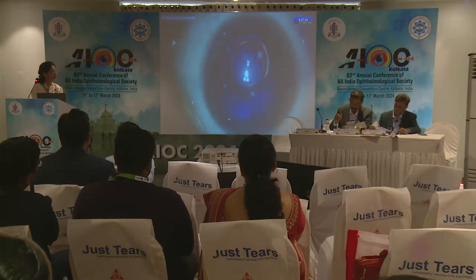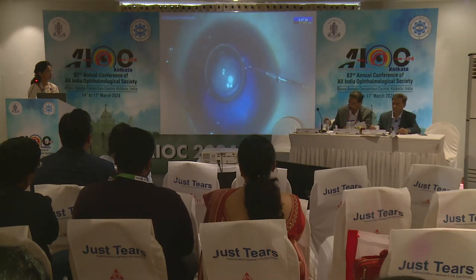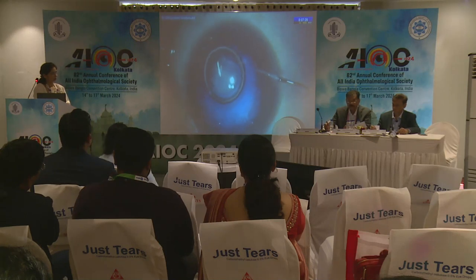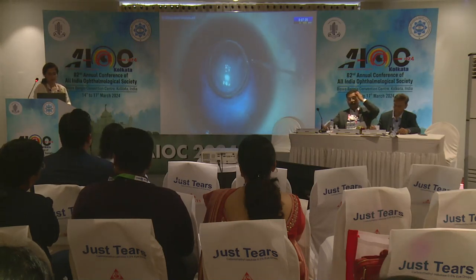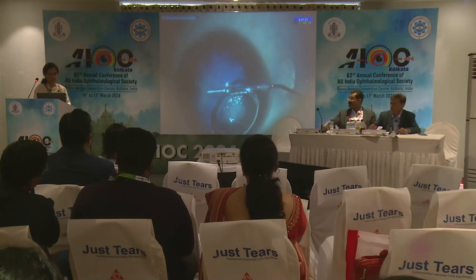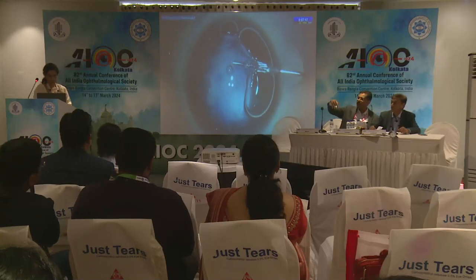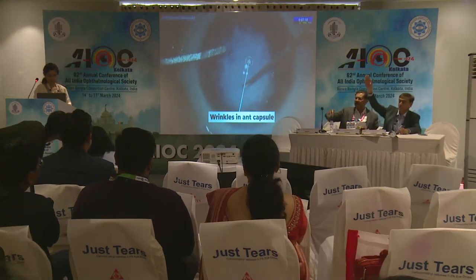The greatest challenge in this case would be making the anterior capsulorhexis. So my strategy here is to make a small initial capsulorhexis, then separate the fibrous membrane from the anterior capsule, and then make a large secondary capsulorhexis.